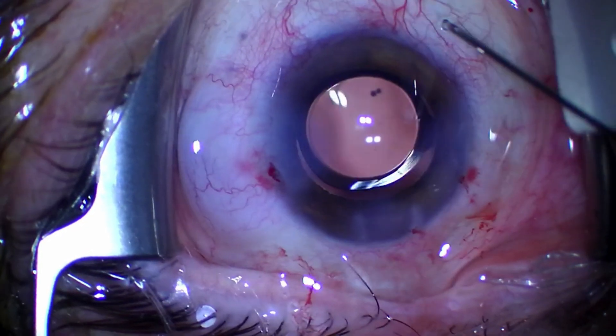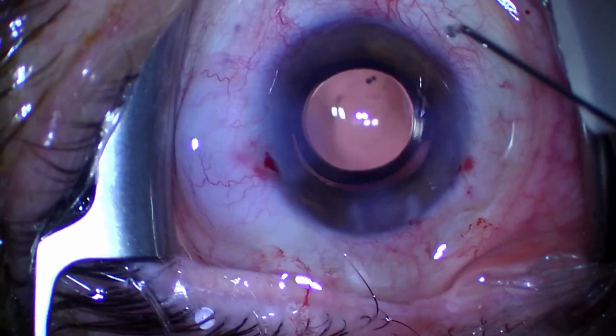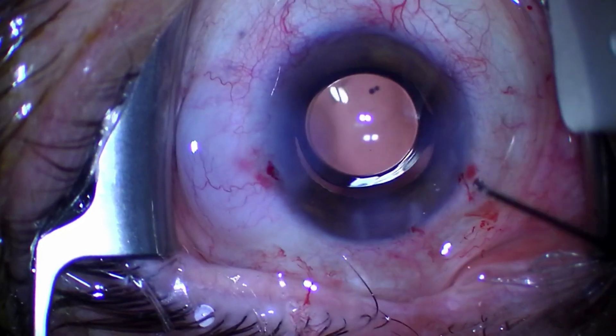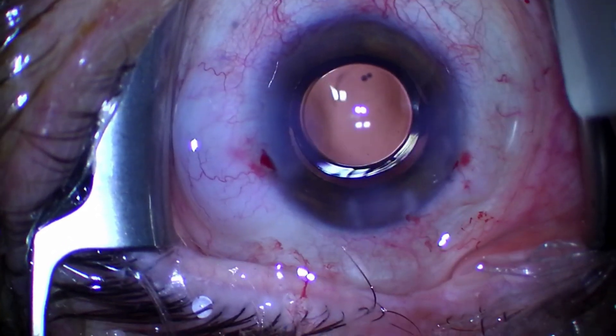Alternative number 3 is pushing on an existing paracentesis. If you have an IOP spike in the early postoperative phase and you can still find your paracentesis, you can release some aqueous through there. You just need to take a blunt instrument like a cannula and push on the outer lip of the paracentesis — this will gape the wound temporarily and let some aqueous out. For beginners, it's usually easier to put some fluorescein in and do this under blue light, using the Seidel effect to see how much fluid is exiting the eye. I don't have a slit lamp video of this, so I'm showing a surgical video of me doing this at the end of a phaco.